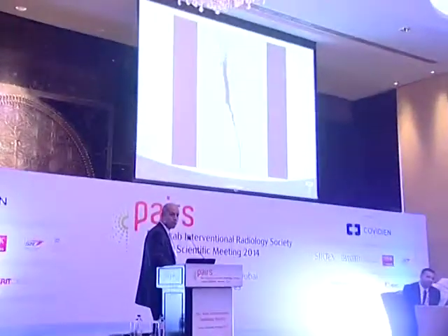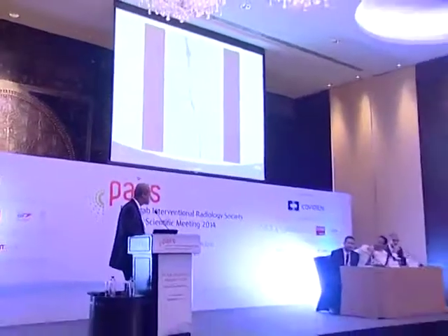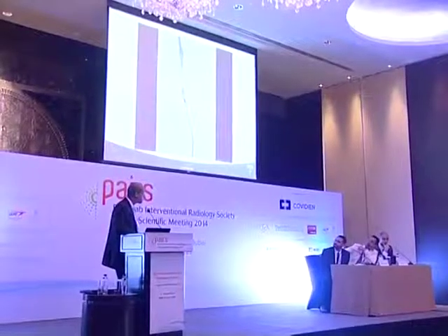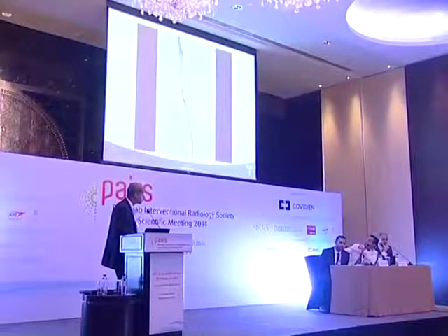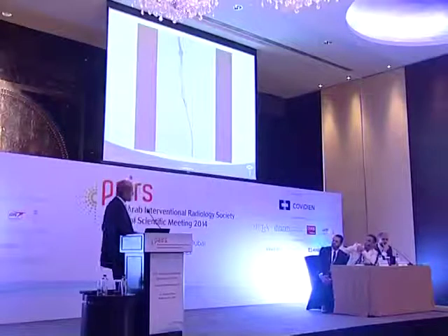No, I don't, but let's assume that they were fine as he was describing the operator note, and this is what we got right now. So what do we do with this? Any takers? We have to make communication between the proximal third and the distal third of the SFA, and cover the situation with the communication of the vein. Okay, so we have to find the track.